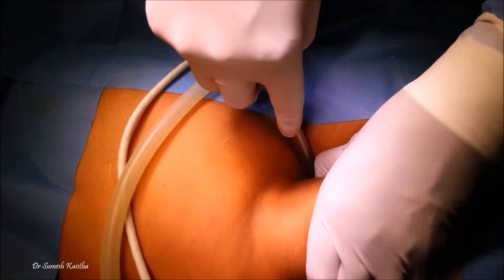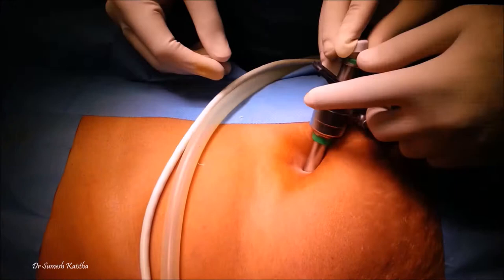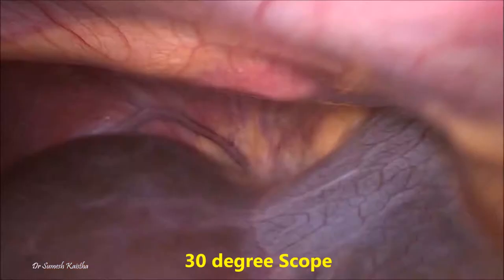Pneumoperitoneum is created to 12 to 13 millimeters of mercury. You can go up till 15 millimeters of mercury. There is no evidence that low pressure adds safety.